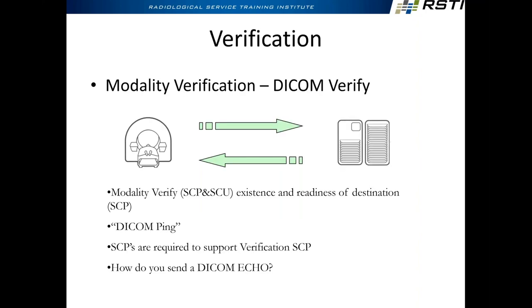Now, modality verification, which we call DICOM verify or DICOM echo, the modality sends the handshake, no actual information is exchanged, no images are stored, no patient data is exchanged. It's just a handshake. Hey, Curtis, can we talk? Yes, we can. That's all that happens. But if this DICOM verification or DICOM echo works, what does it tell us? Even though no information actually changes hands, they're configured properly. The hardware is good, they're communicating, and the software is configured properly.